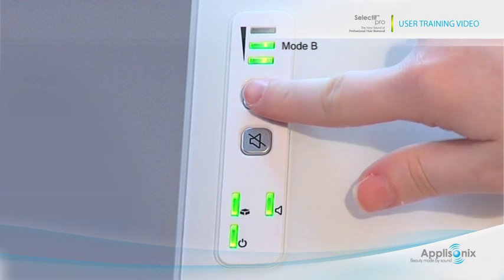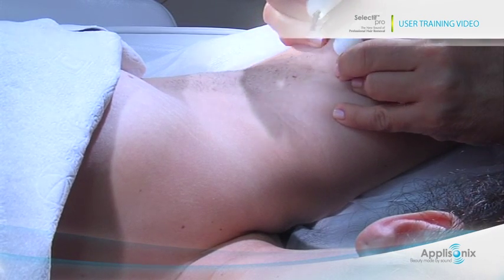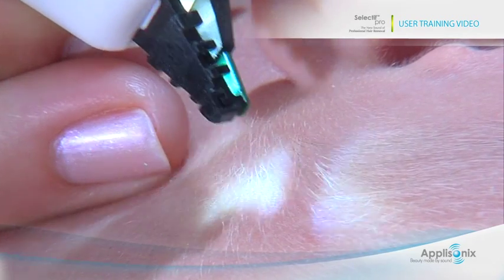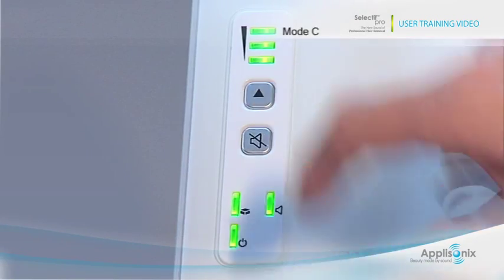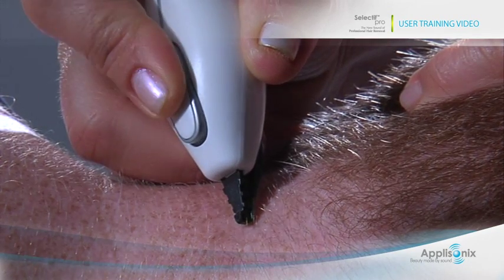The second treatment mode is optimal for armpits, bikini line, beard, and legs. And the third mode is for the areola, neck, and upper back.